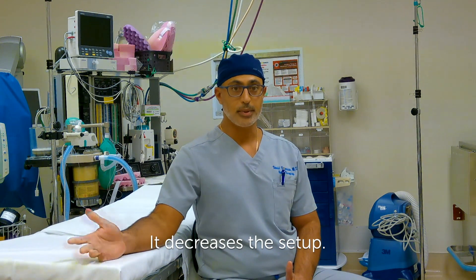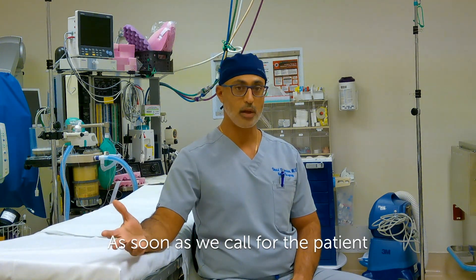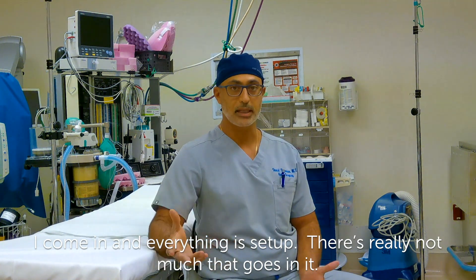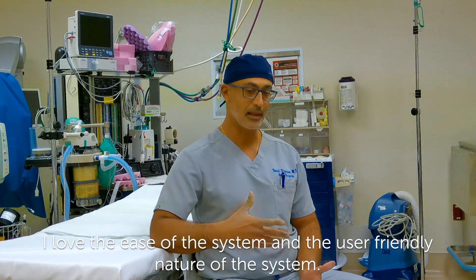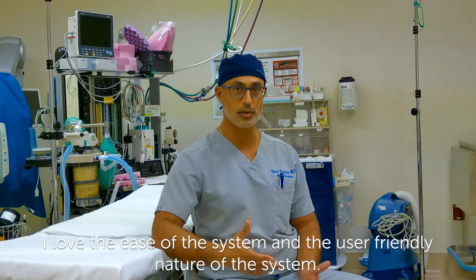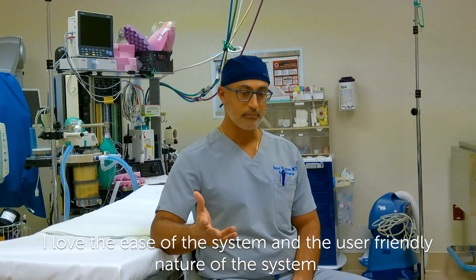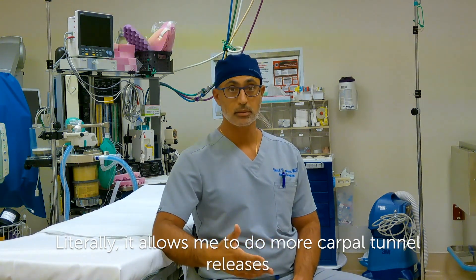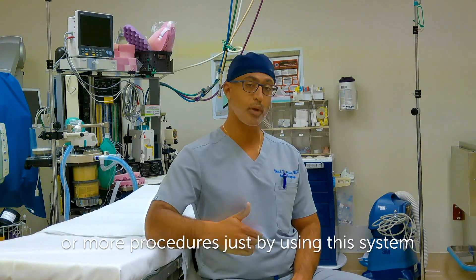It decreases the setup. As soon as we call for the patient, I come in, everything's set up. There's really not much that goes in it. I love the ease of the system and the user-friendly nature of the system. And literally, it allows me to do more carpal tunnel releases or more procedures just by using this system.